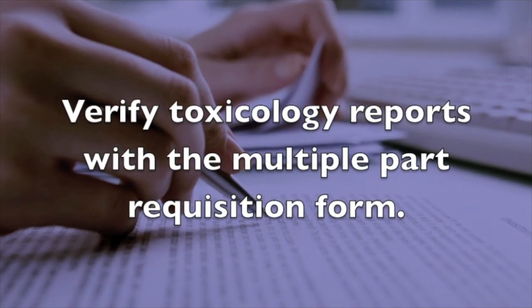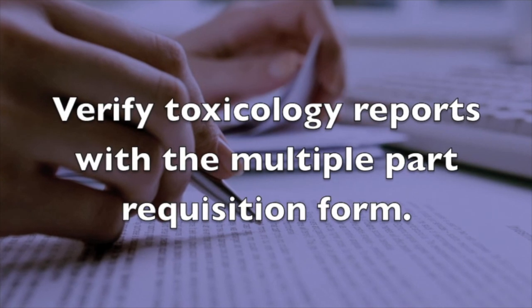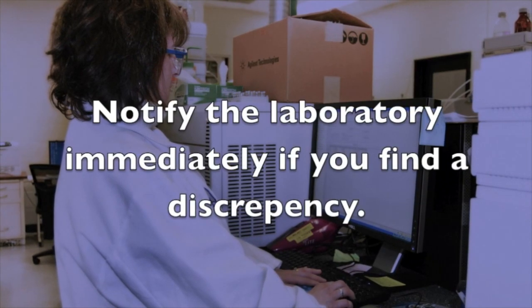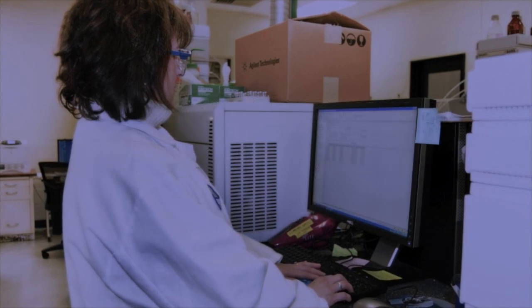When the client receives the final toxicology reports, it is very important to verify that all of the identification numbers and names match with the numbers and names from your copy of the multi-part requisition form. If you observe any discrepancy, please do not hesitate to notify the laboratory to investigate.